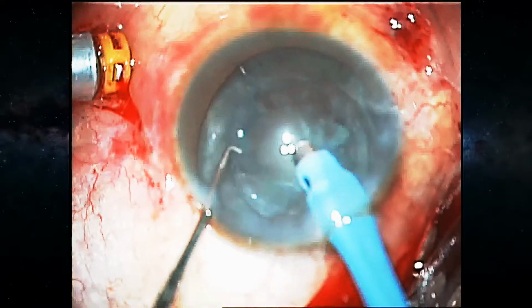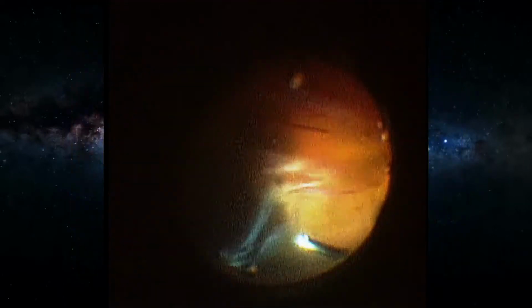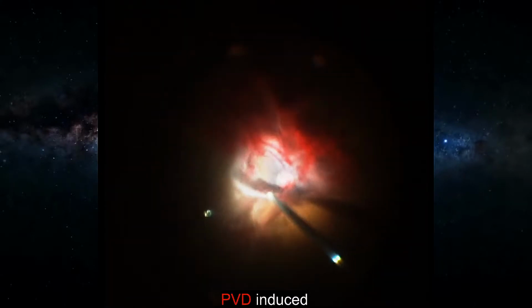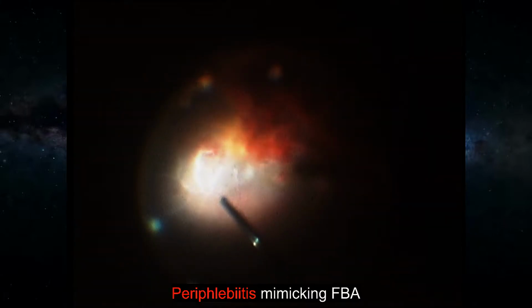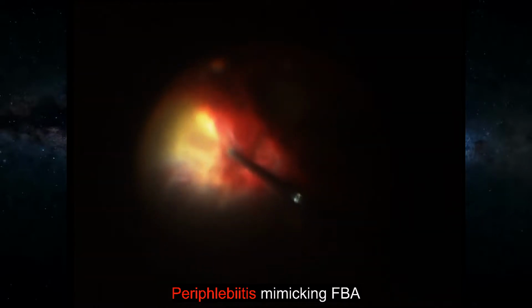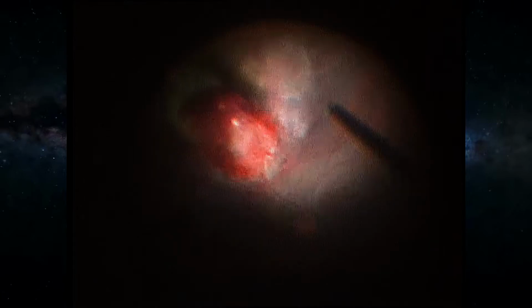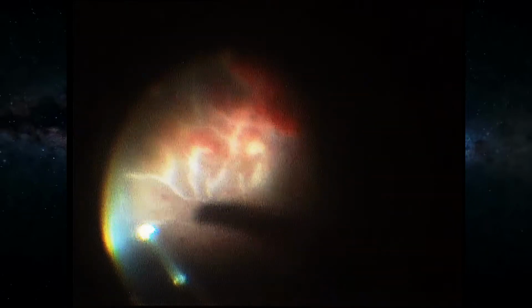Cataractous lens was removed and 3-port pars plana vitrectomy was commenced. After sufficiently removing the dense vitreous hemorrhage, posterior vitreous detachment was induced. On further clearing the vitreous, the temporal retina revealed a frosted branch angiitis-like picture and an encapsulated foreign body in the inferotemporal retina. The extent of damage that this small foreign body has inflicted on the retina can be seen.